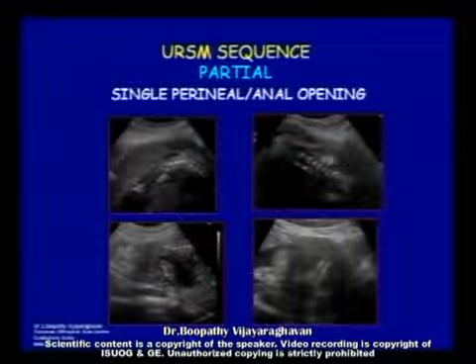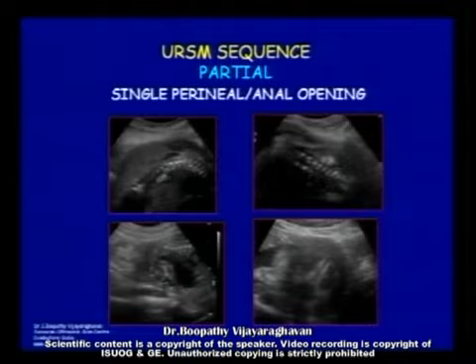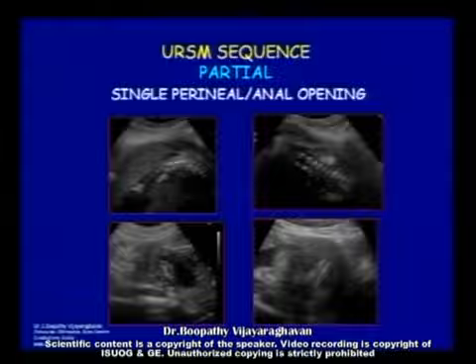Now, we cannot make this out antenatally because we cannot see the perineal opening. Whether it is partial or complete can be determined only at autopsy. The partial URSM sequence is more important because of the spectrum of appearances we see on antenatal ultrasound.